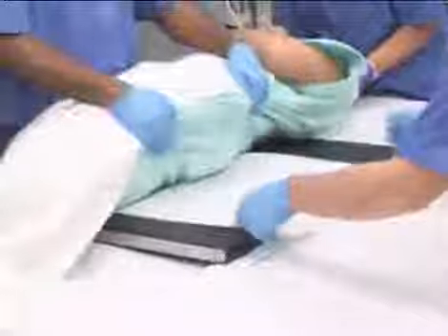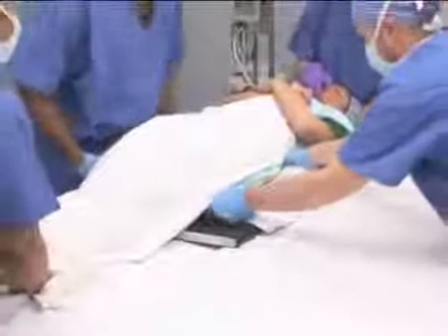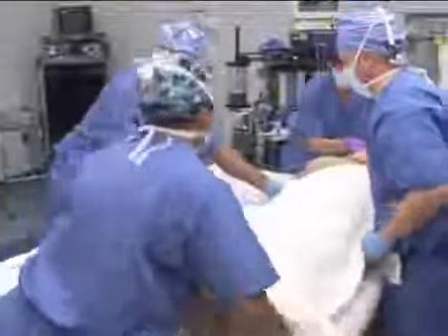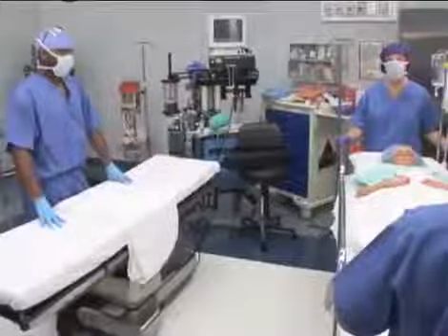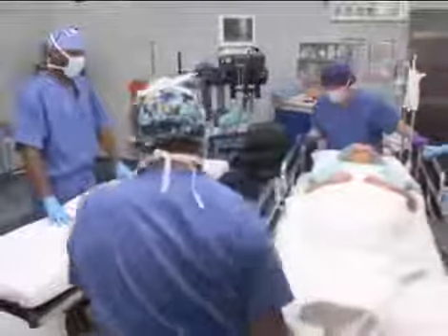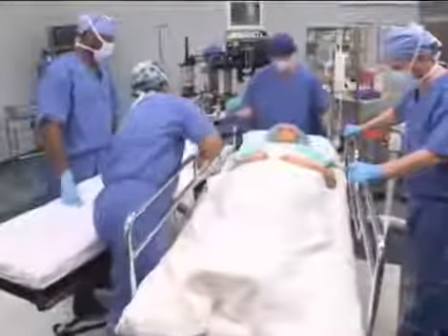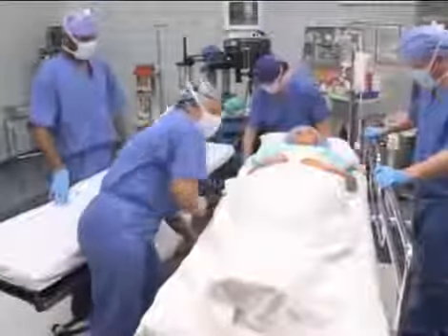An important role of the circulator is to safely transfer patients to and from a variety of conveyances, including stretchers, beds, wheelchairs, and the operating table. The transportation and positioning of patients in the healthcare setting is among the responsibilities that creates the most risk for patients and care workers alike. Patients may be unsteady or semi-conscious, unable to use protective mechanisms that would normally prevent falls or other injuries.